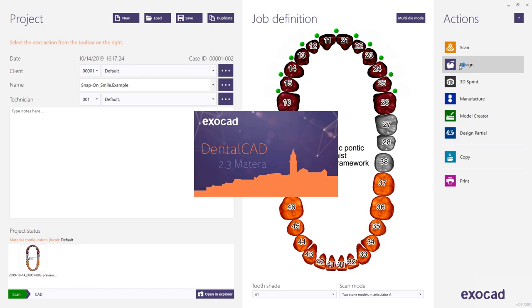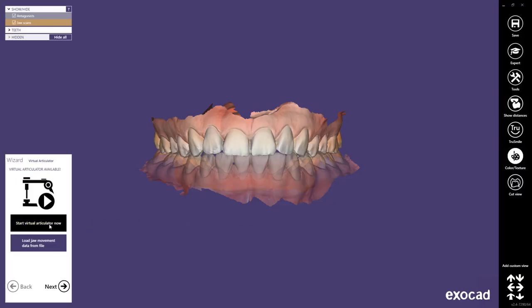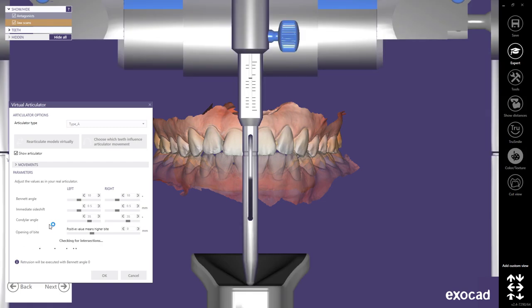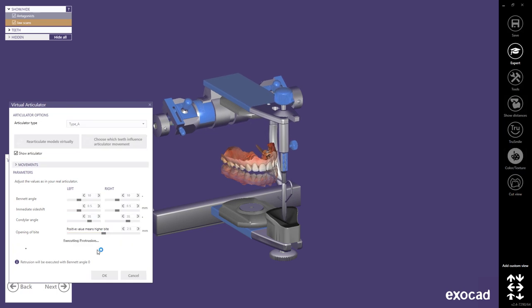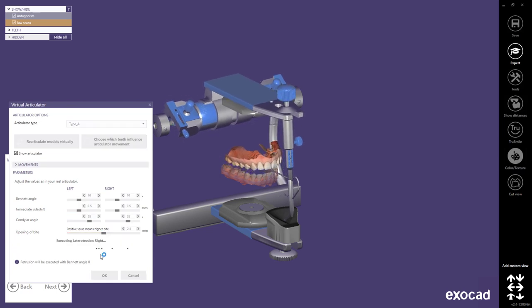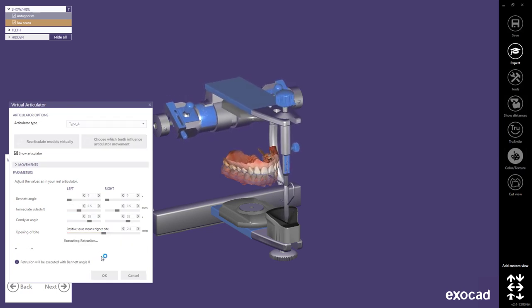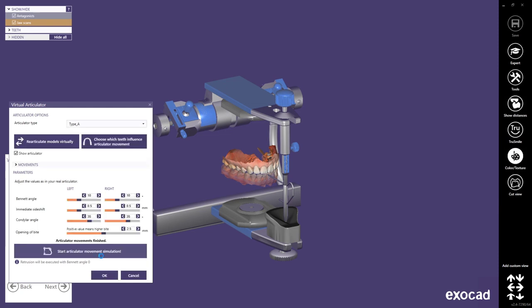The reason why I selected only Anatomic Pontics will be apparent later on in the partial framework software. In the first step I'm directly starting the virtual articulator. Using the parameter opening of bite I can set up a gap between the upper and lower jaw, then I start the virtual articulator and the movements get applied. This is not only used to open the bite but also because it gives me the option to dynamically adapt the occlusion to the antagonist in a later step.